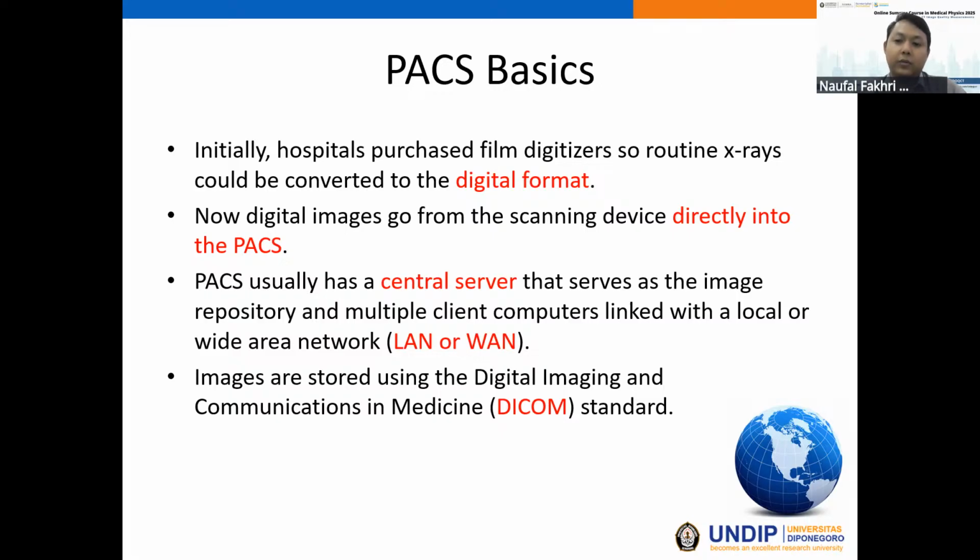So after we scan or expose a phantom or patient, usually the digital image can be directly stored in the PACS server. PACS usually has a central server that serves as the image repository and multiple client computers linked with a local or wide area network, in this case LAN or WAN. Images are stored using the Digital Imaging and Communications in Medicine, or DICOM, standard, as DICOM files.